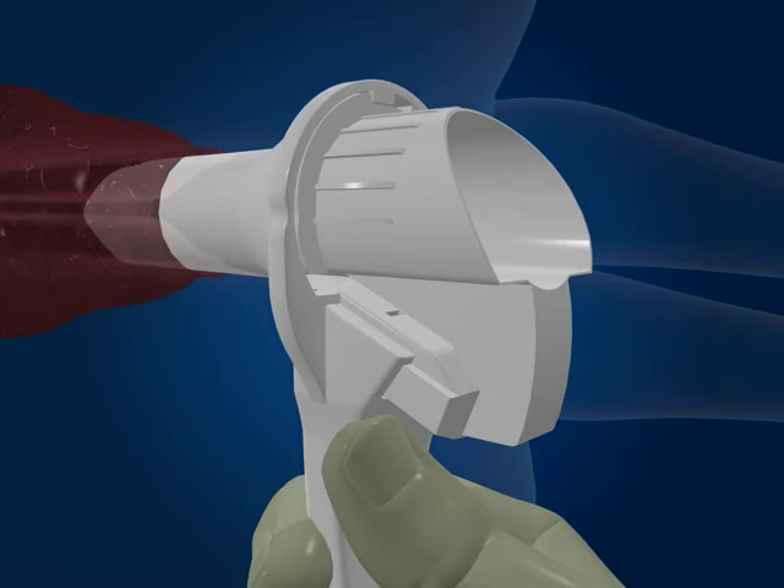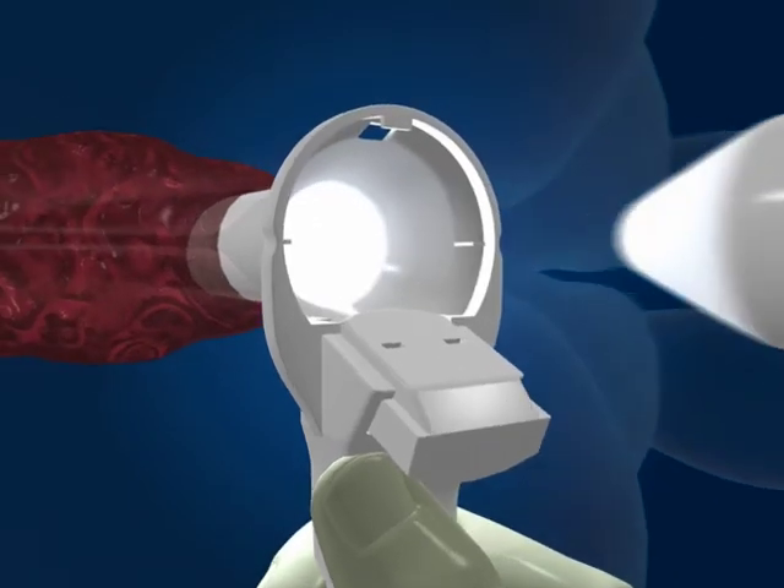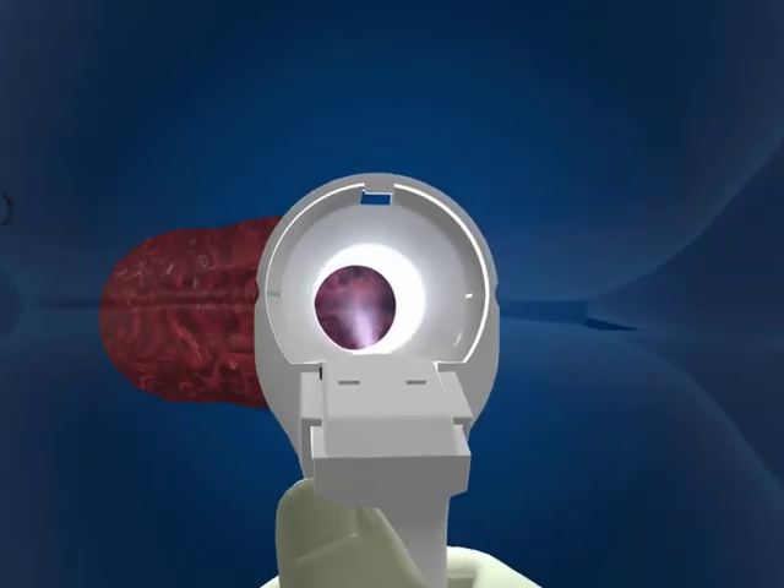Securely hold the device and twist the obturator anti-clockwise until it clicks or visually unlocks. Smoothly remove the obturator to automatically switch on the light.